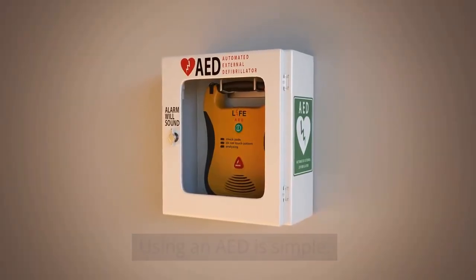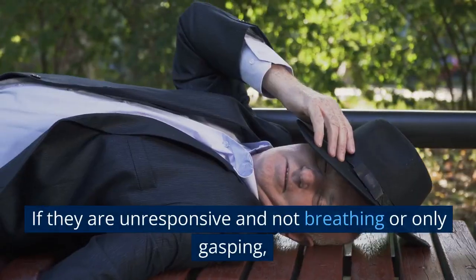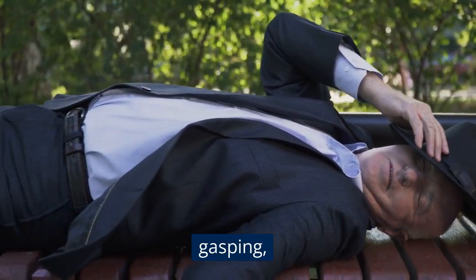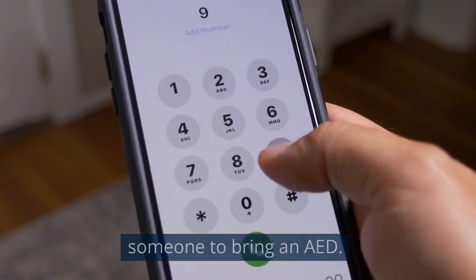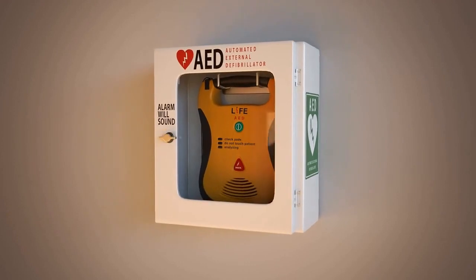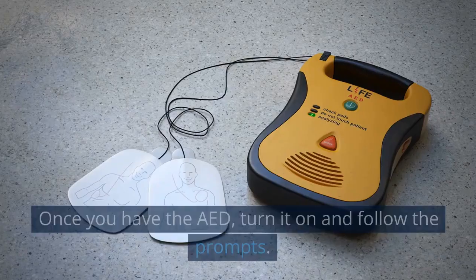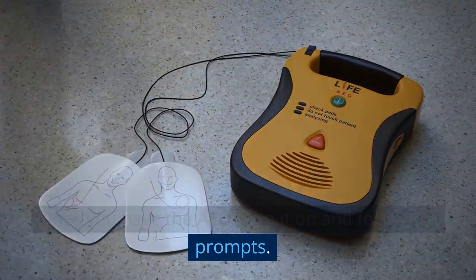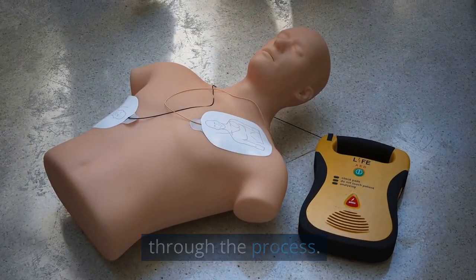Using an AED is simple. First, check the person's responsiveness and breathing. If they are unresponsive and not breathing or only gasping, call emergency services immediately and ask someone to bring an AED. Once you have the AED, turn it on and follow the prompts. Most AEDs will have voice prompts to guide you through the process.